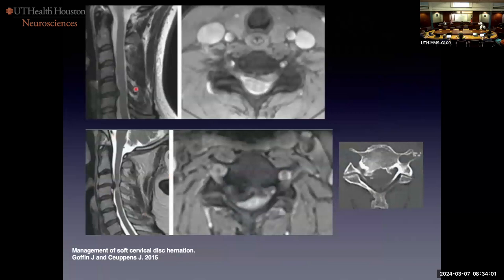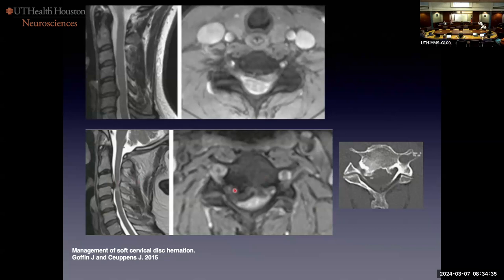How else do we use this? Roy likes to look at disc herniation on axial GREs. If it's really bright, that suggests a soft or more acute herniation. On the other hand, if it's very black and gets blacker on the GREs, this suggests calcification or a terribly desiccated disc. If you see something really black behind the disc and it gets darker on GREs, you might want to do a CT scan if it matters.